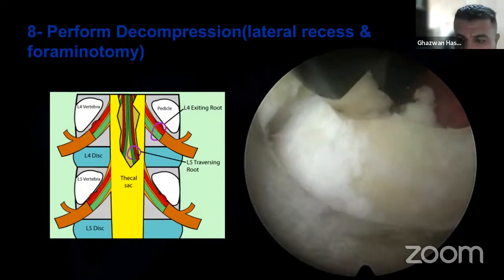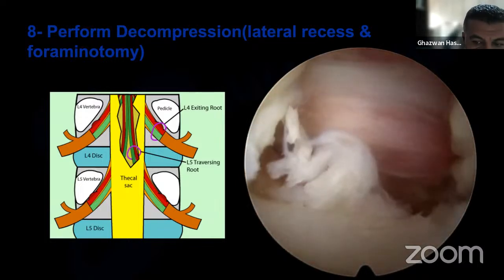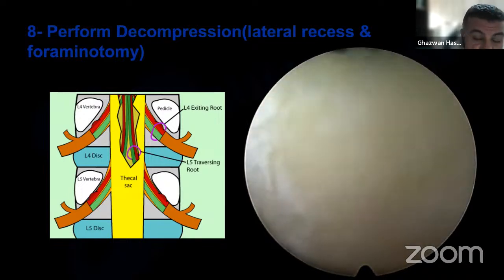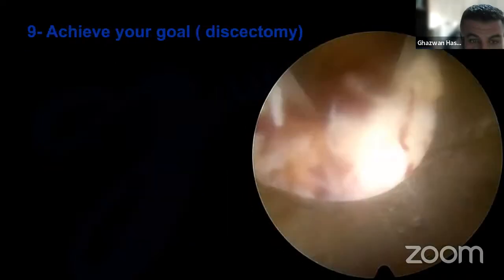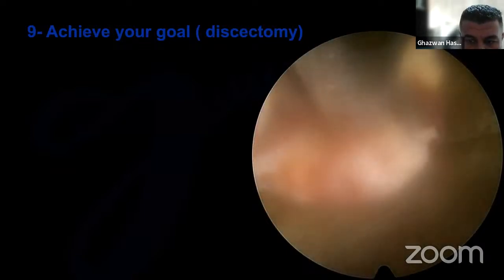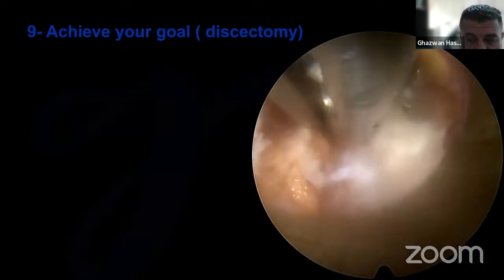It not only decreases the symptomatic recurrence rate, because the root has a good space to include some recurrent disc in the future if it happens. And then you will end up, let's say, landing on the disc. There are many options available.